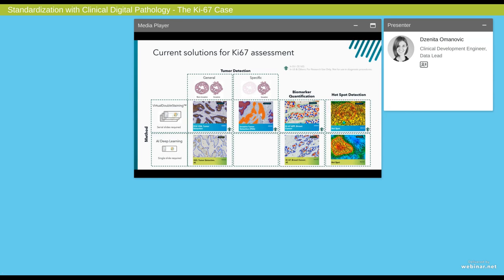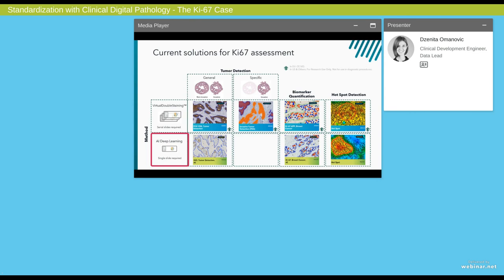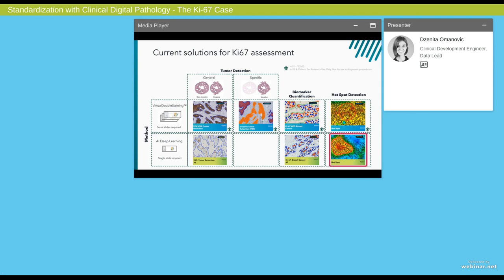Now on the research side of things, we offer an AI and deep learning based approach. Here we have a tumor detection application that consists of a pre-trained deep neural network that detects tumor based on tissue morphology. The method does not require any additional tissue section, but detects tumor straight in your biomarker slide and is therefore easy to apply. Then we also have a KI-67 solution based on AI. This one can then go in and find positive and negative nuclei, and you can combine all of this with a hotspot app as well.